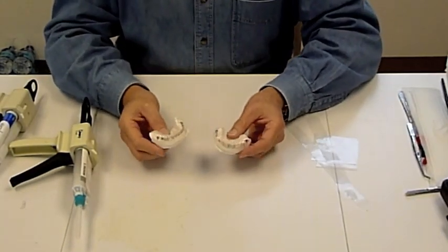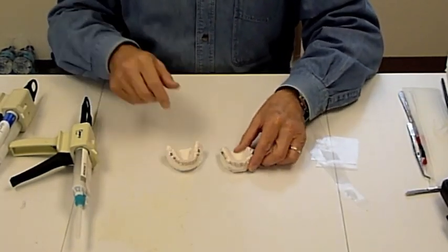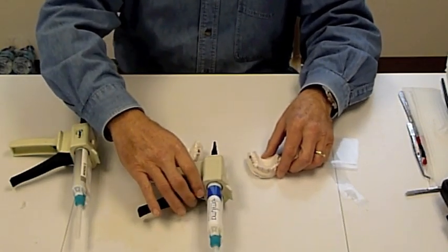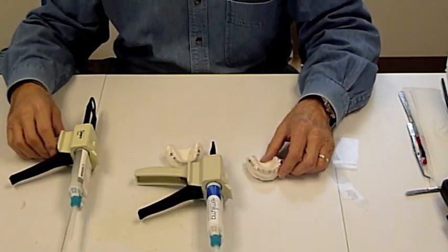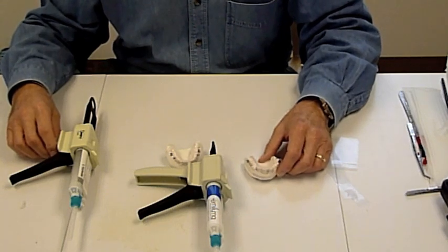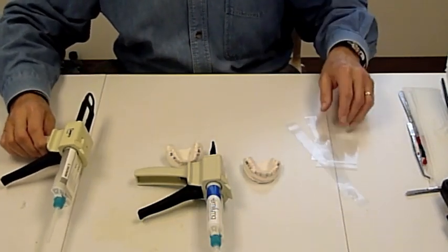We've got our boxing wax placed on here, we've got our emiluma to use. The emiluma holds the brackets in place, and then the memosil which creates the stiffer tray.